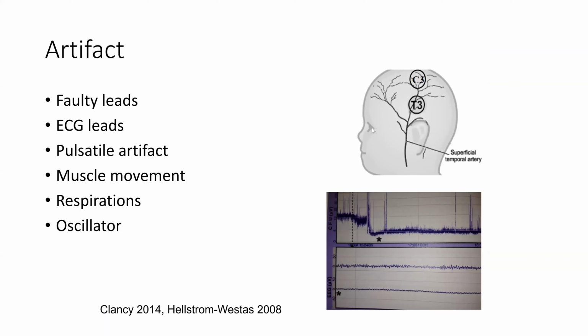Yeah, it could be movement. It can also be padding. Pat, pat, pat, mom's patting the baby. And that can be a very confusing thing to see on the aEEG.